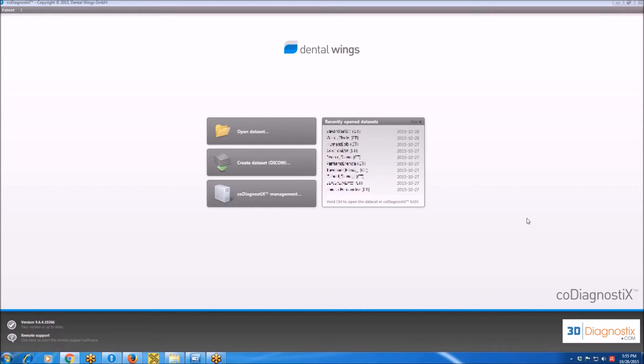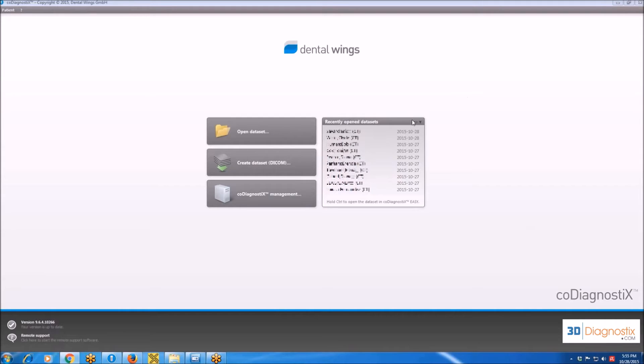In this video, we are going to start the CoDiagnostics Software Essential Training. While we are looking right now at the home screen of the software, you are going to find two windows.